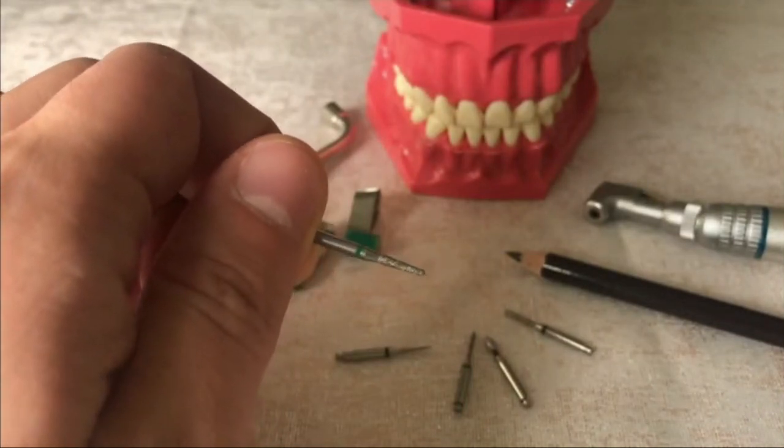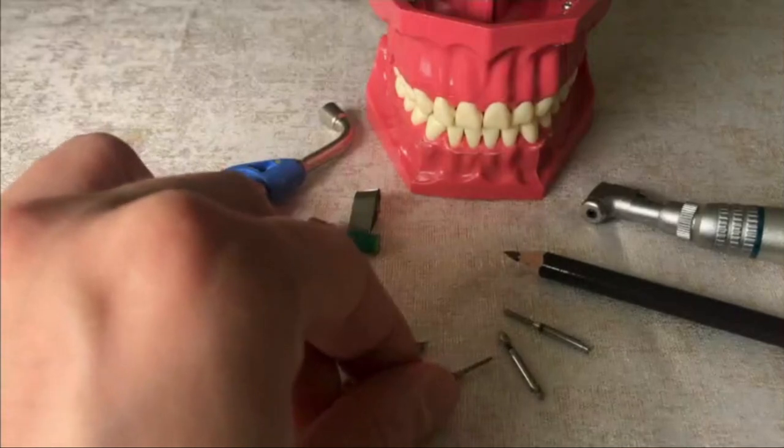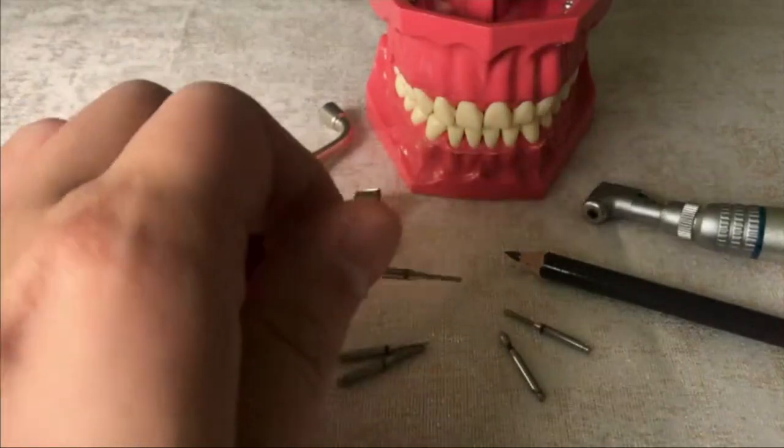The first one is the tapered burr. Its axial parts have a 3 to 6 degree slope. That's why it is called a tapered burr.